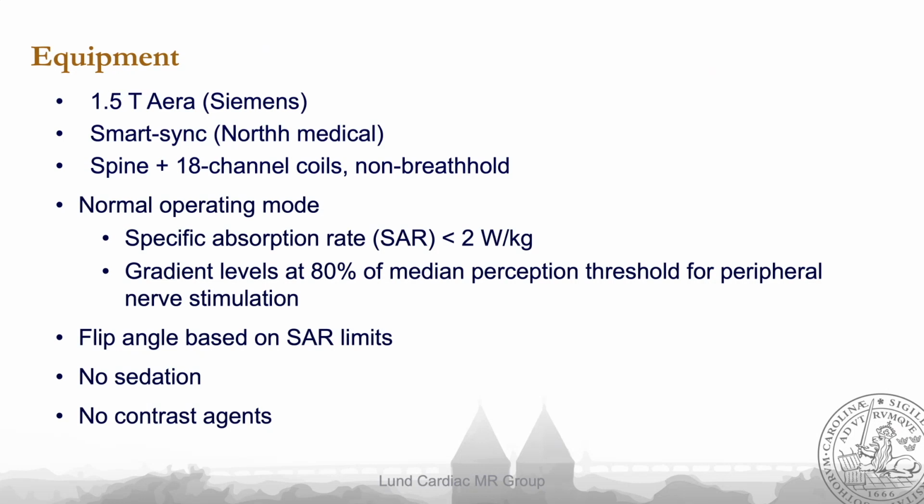And this, together with the no sedation and no contrast agents, is very likely to be discussed further, also at the coming ISMRM in early June in Toronto, considering the general safety restrictions and guidances we do have for fetal and dedicated cardiac fetal CMR.